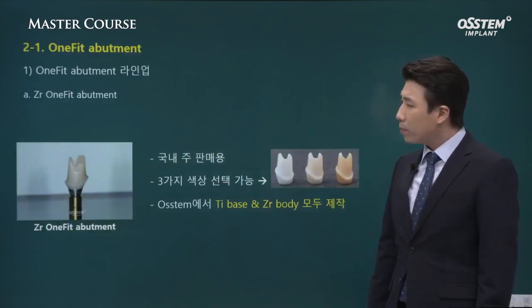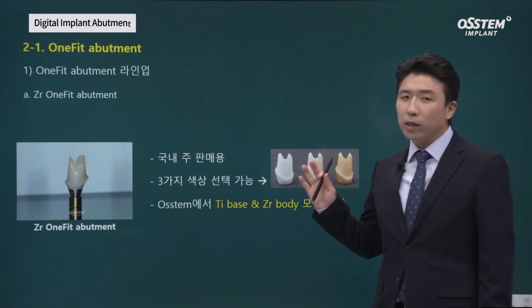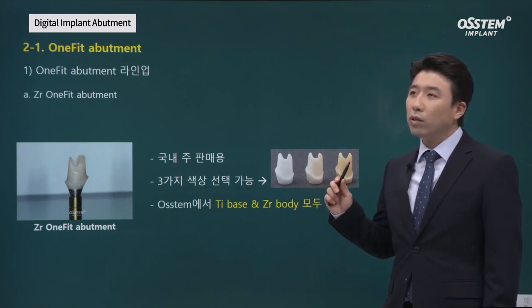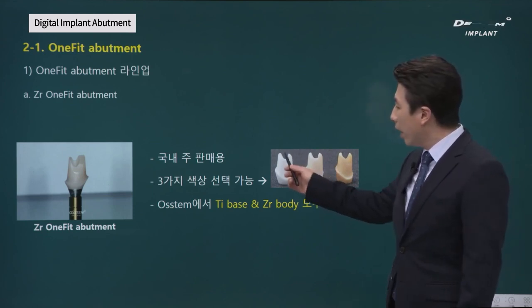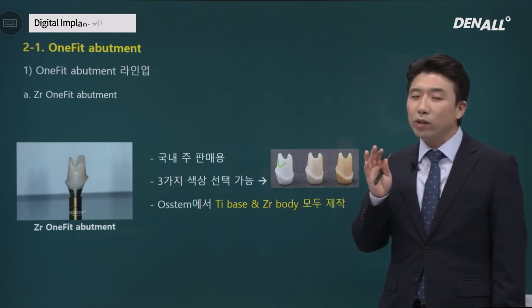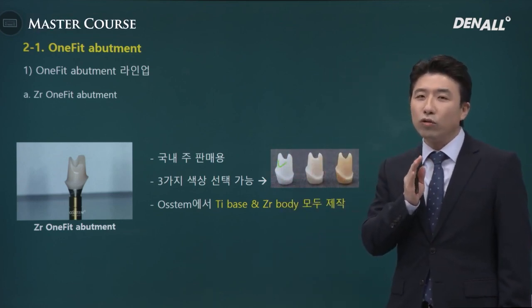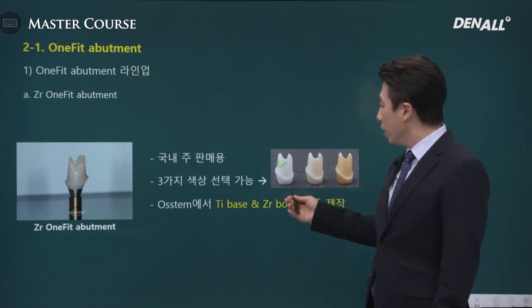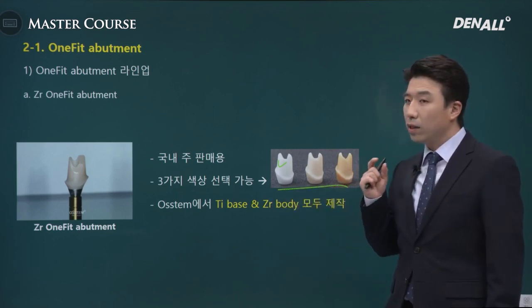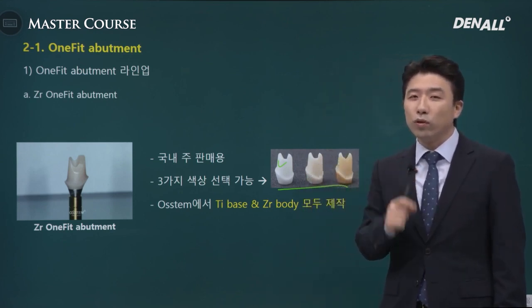In the case of abutment for link abutment, you can make it white. But if the patient's natural teeth have a darker shade, we can vary the color of the abutment like this. These options are available, so you can use amongst the three colors. These options can be chosen.